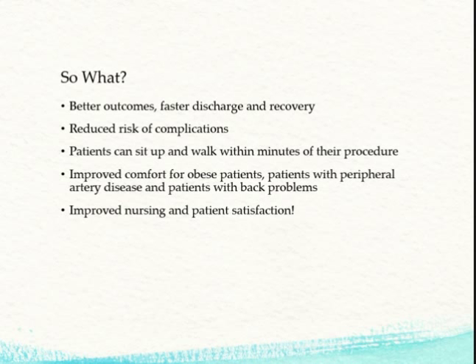So why do we care? Well, it leads to better outcomes, faster discharge and recovery, reduced risk of complications. Patients can sit up and walk within minutes after their procedure, and there's usually increased comfort for your obese patients, patients with peripheral artery disease, and patients who have back problems. The other thing is it also improves nursing satisfaction and patient satisfaction, because it's a lot easier to manage one of the patients with a TR band than it is a femoral sheath.